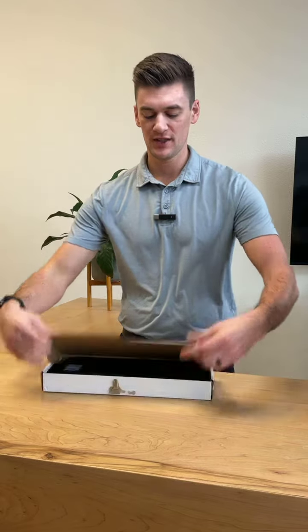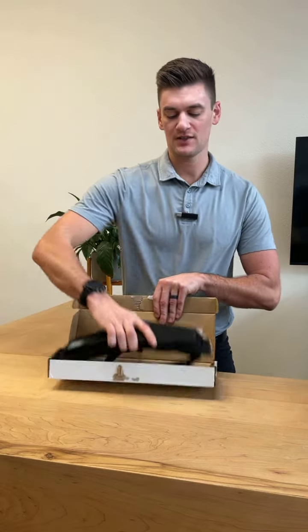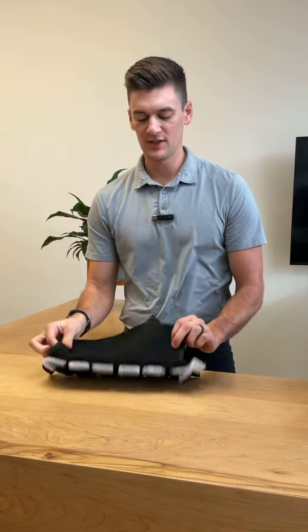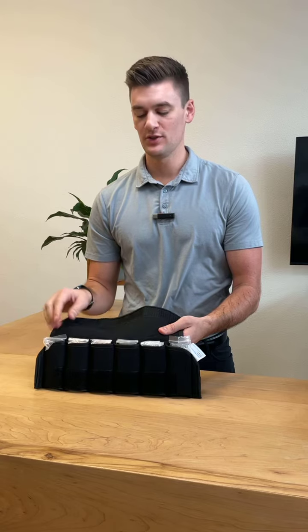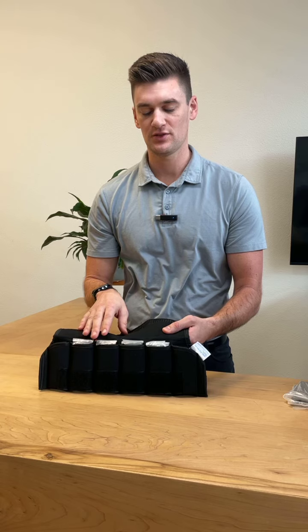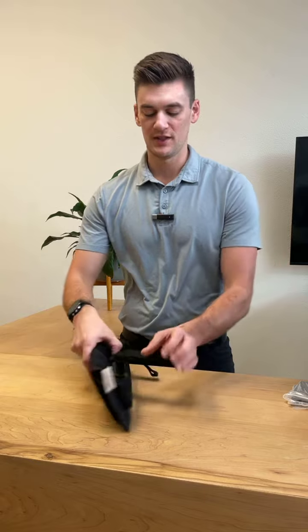Hi guys, Dr. Tanner here. Today we're talking about unboxing and setting up your at-home head weighting system. When you initially take your head weights out of the box, the first thing you're going to want to do is lift up on the velcro flap here. This lets you get access to the half-pound weights that are installed here. You'll want to remove the outer head weights — this is typically where doctors recommend patients start, because it allows you to begin your corrective head weighting at two pounds total.